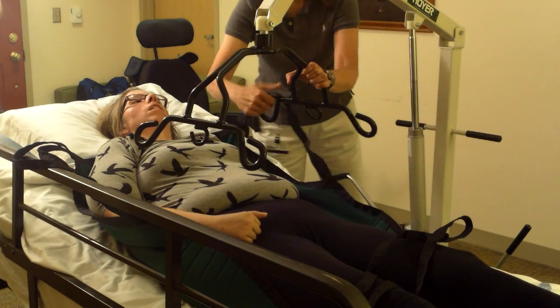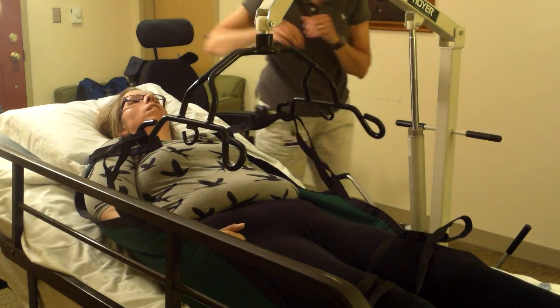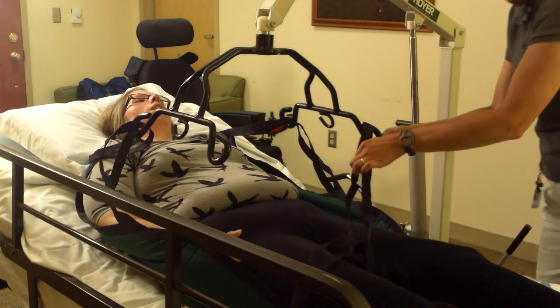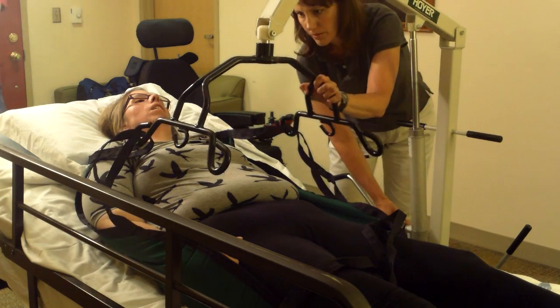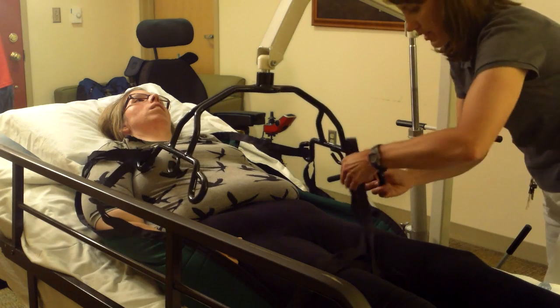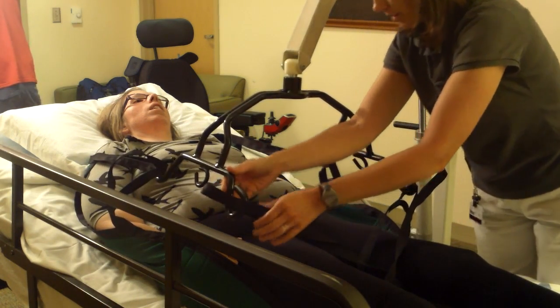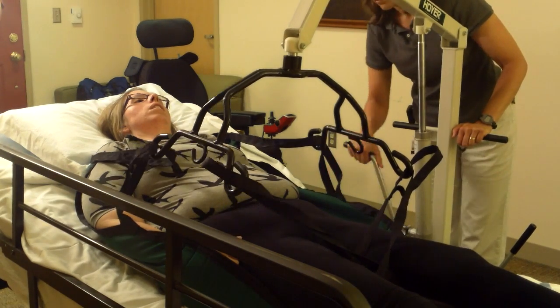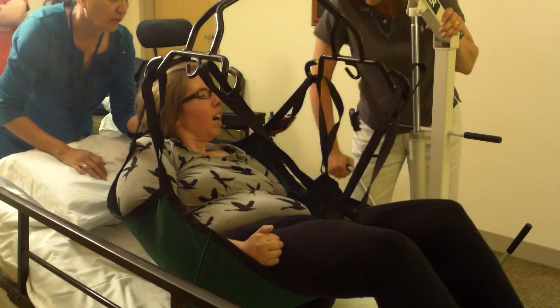We will now bring the Hoyer lift back into position. Put the loops through into the lifting mechanism. You may have to adjust the lifting mechanism to help with putting the loops in. Remember, the loops have to be put in correctly at the same level. Again, you're going to tighten the knob and pump up so you lift the patient out of bed.